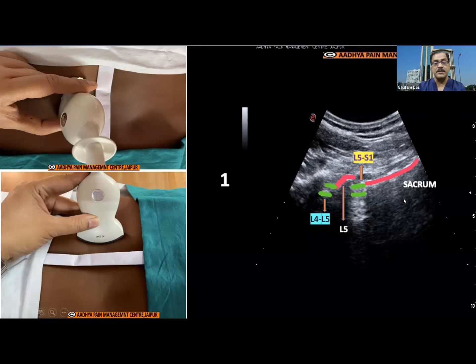This is again how to count it. That is again very easy. Mostly it is done by the parasagittal view, where you see the sacrum continuously, and then when the first break comes, that is L5S1. But again, it might be misleading sometimes, because if there is lumbarization or sacralization, then this might not be a whole group. That is the reason why, to identify the level, it is always better to have an X-ray. And again, lumbar spine procedures are better done in the hybrid technique.